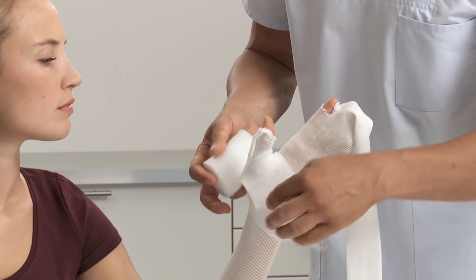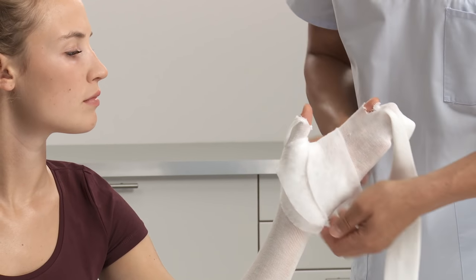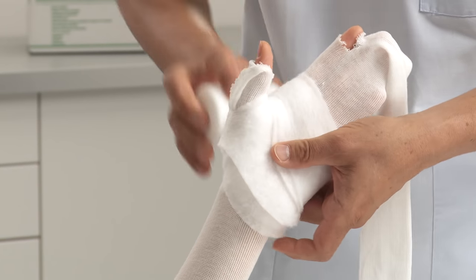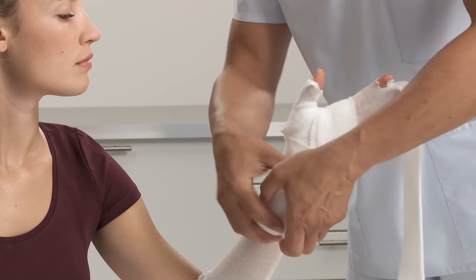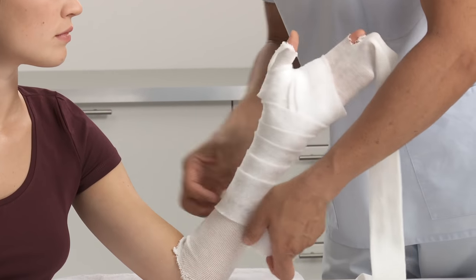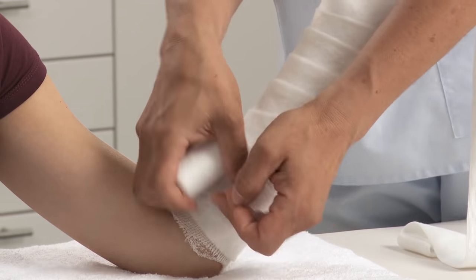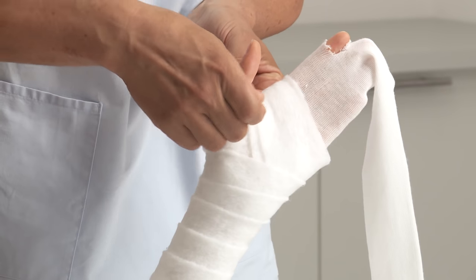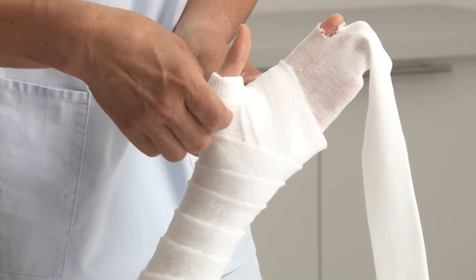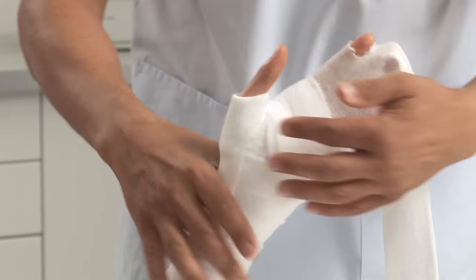Now apply one roll of padding starting at the distal side of the arm. Go through the web space twice and work with an approximate overlap of 50%. Fold over the thumb stockinette to create a soft edge of the thumb area and smooth down.